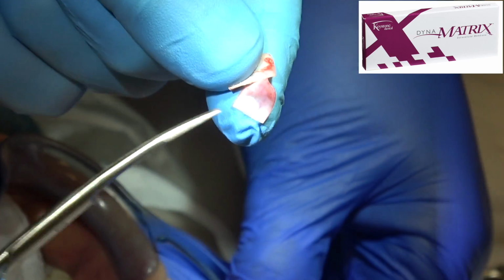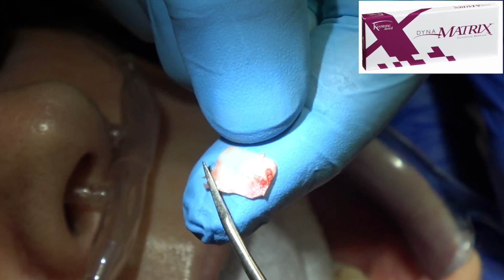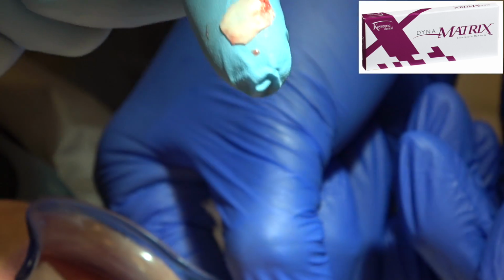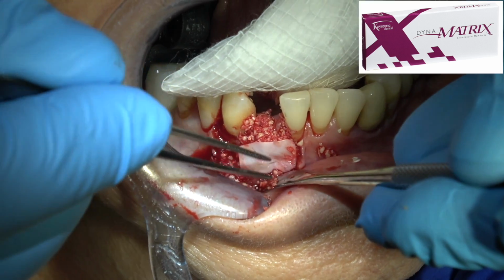So the resorbable collagen membrane gives the bone about a 3-month head start on the soft tissue, because the soft tissue grows faster than the bone. So you want to give the bone a head start on the soft tissue. So this lasts about 3 months.